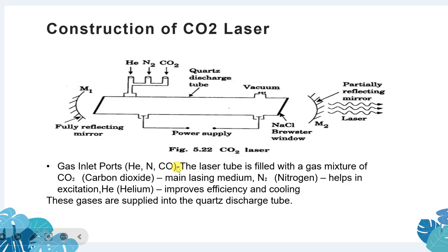Then let me move to the next slide. Here, let me see the construction of CO2 lasers. Here the CO2 laser has gas inlet ports. In these gas inlet ports we will have helium, nitrogen and carbon dioxide.